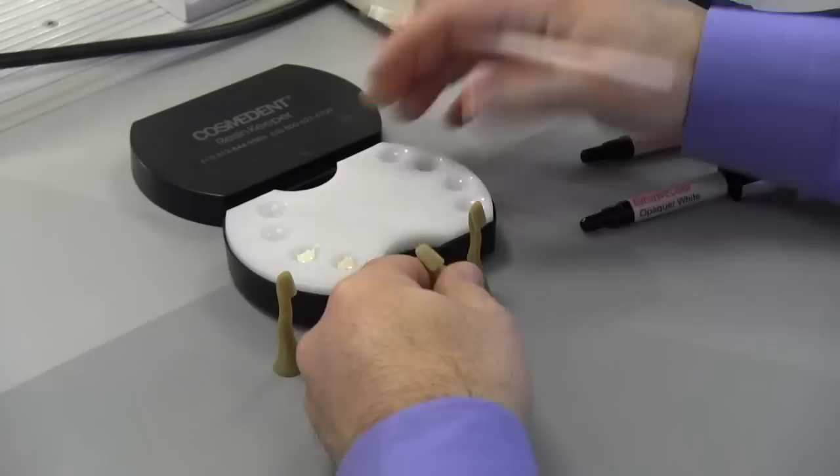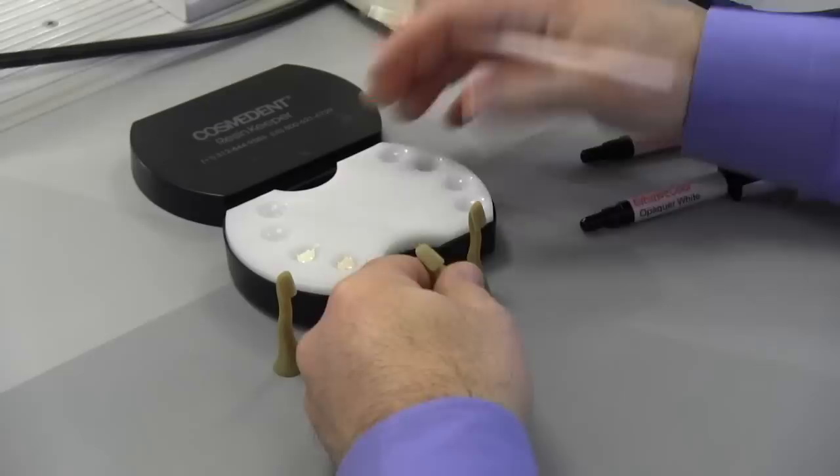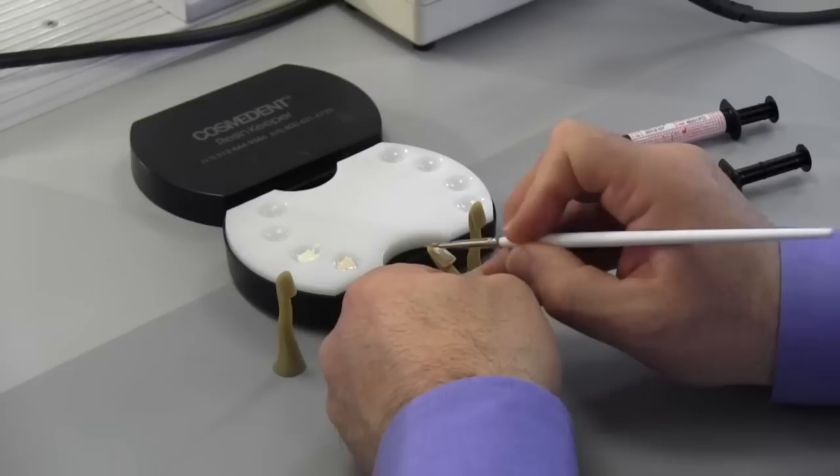After you etch and bond the tooth, you're going to take your white opaque — or what most doctors do is take the white opaque and put a thin coat of opaquer to neutralize that gray, dark brown, or metal.